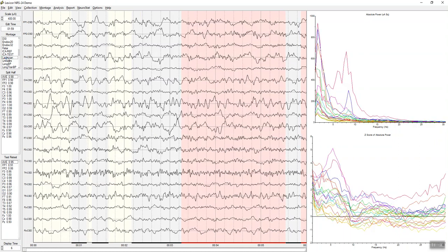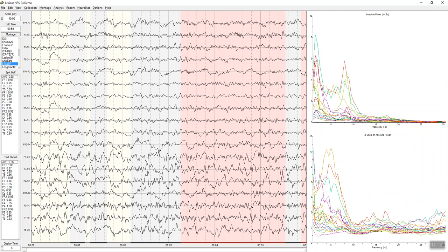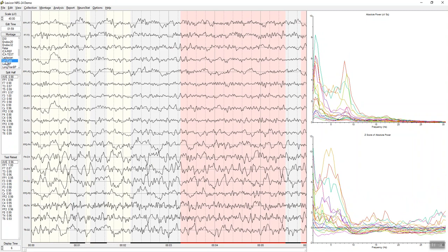Here's a Laplacian montage, for example, that helps for focal events, similar to longitudinal bipolar and average reference. There's a number of different montages to play with. Linked ears is the mother for basically all of those others, including single references that are converted to and compared to a normative database.